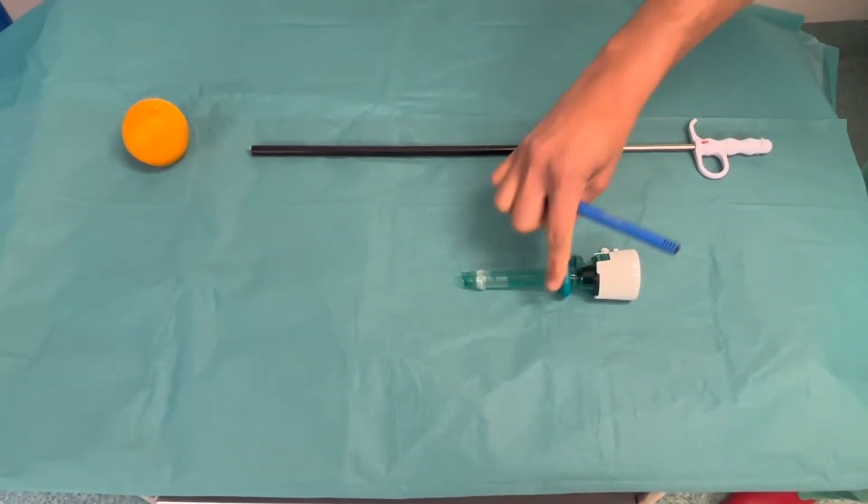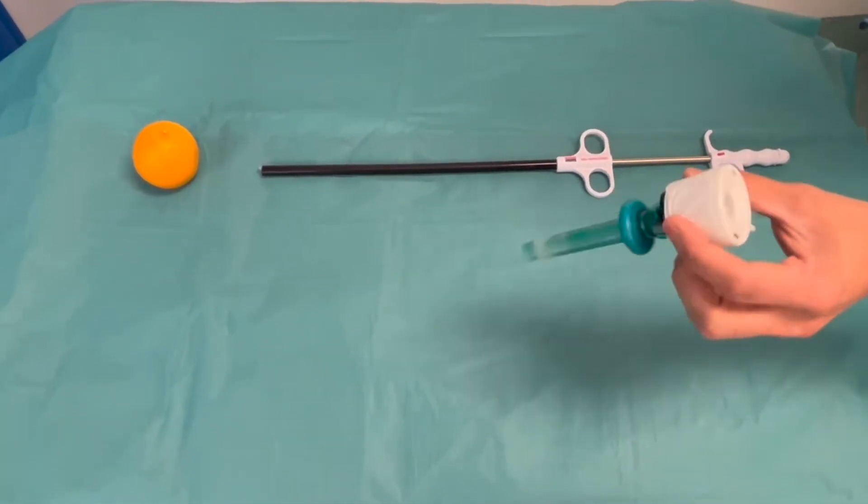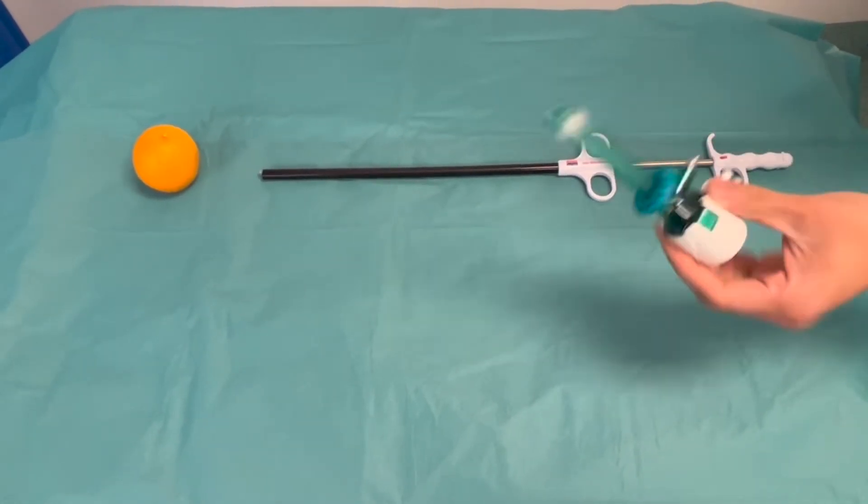This is a video demonstrating insertion of an endobag through a 10 millimeter port. This is the standard 10 millimeter balloon port.